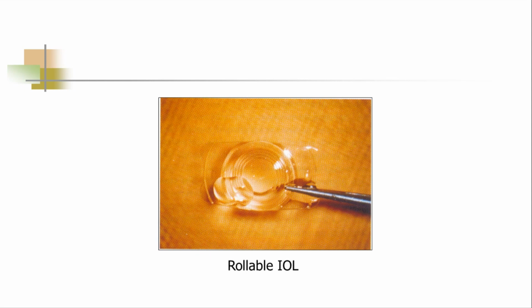These ultra thin lenses are made up of hydrophilic material. The front surface of the lens is a curve that resembles a radius, and the back surface has a series of steps with concentric rings.